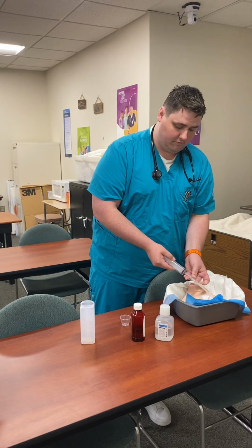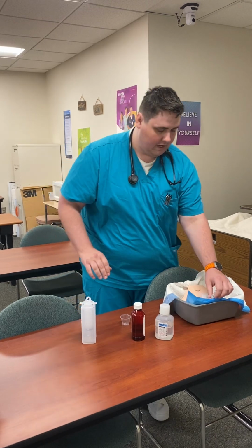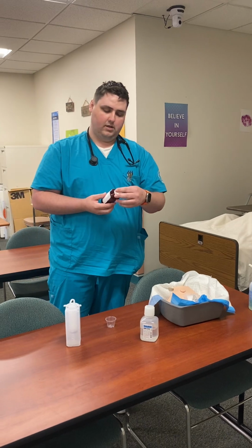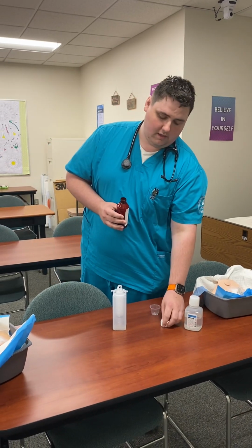So we will remove our syringe here and cap it so that none of our patient's juices backflow out, upon which we will get our med solution. We will check against our MAR before administration, as well as doctor's orders, to verify this med goes to the correct patient and what amount.